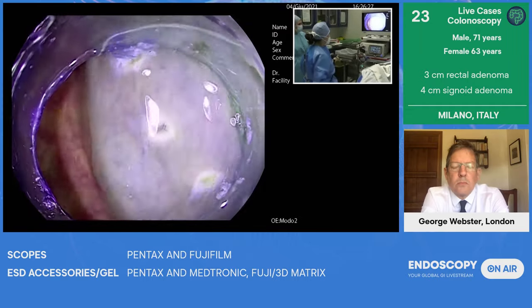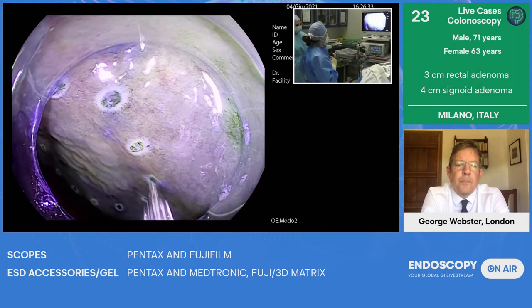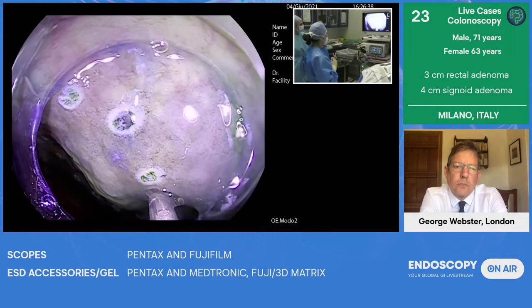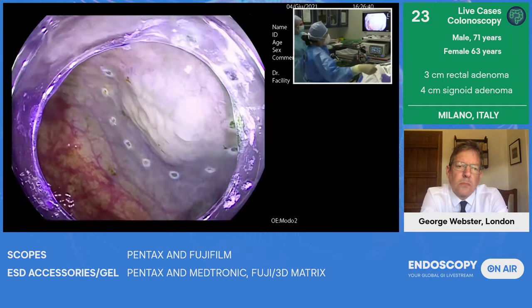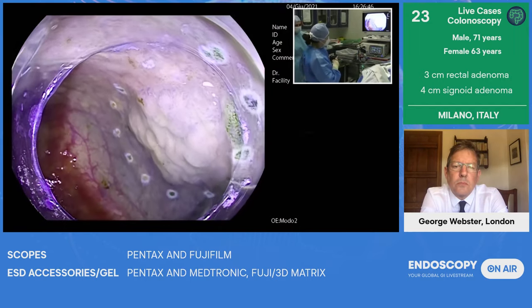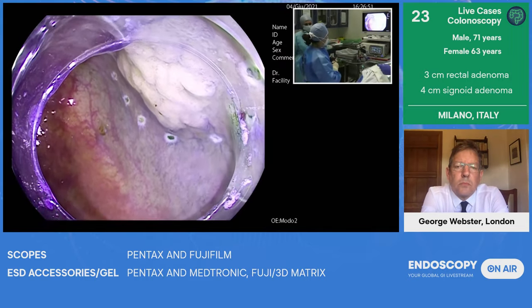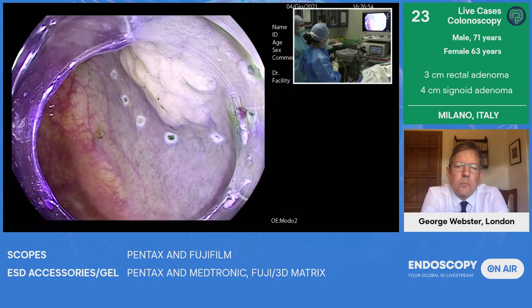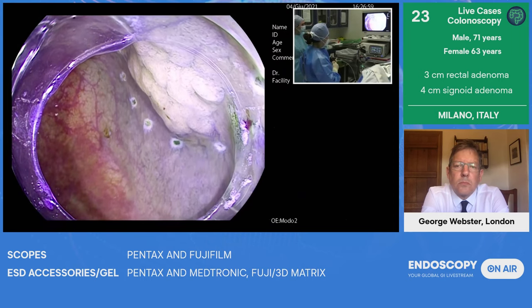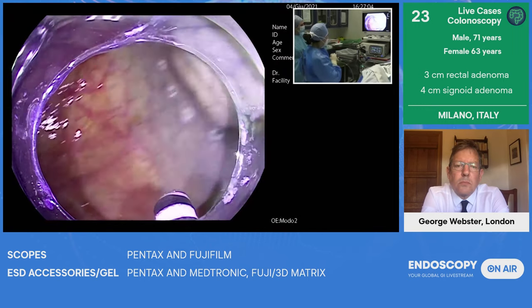Good. Stop. Okay, just a little bit more here. So this snare that I'm going to show you in a few seconds, it's a particular snare from Pentax where you can use the tip of the device, just open it a little bit from the scope, to use it as a knife. And then when you fully open the device, we have a snare. So we can make a hybrid procedure and a hybrid technique to remove even bigger lesions en bloc.